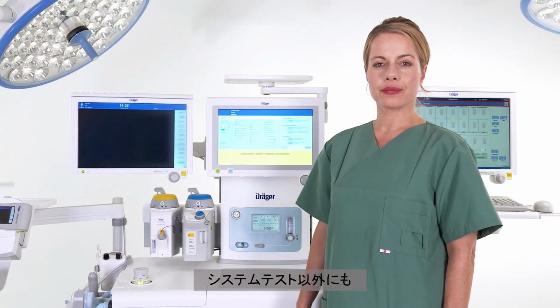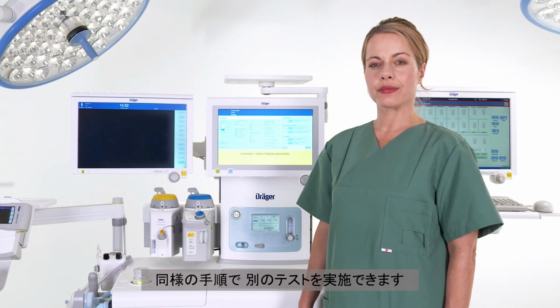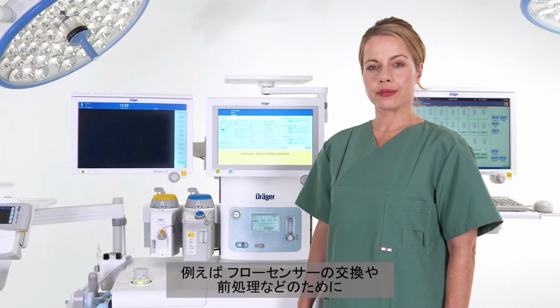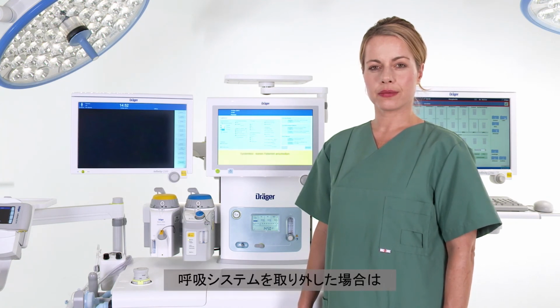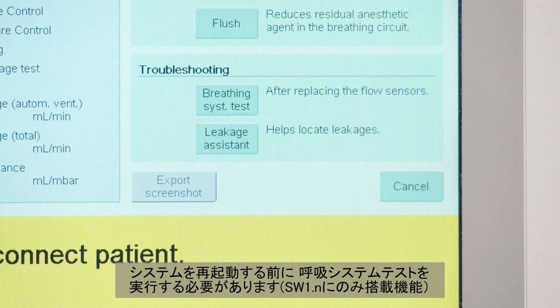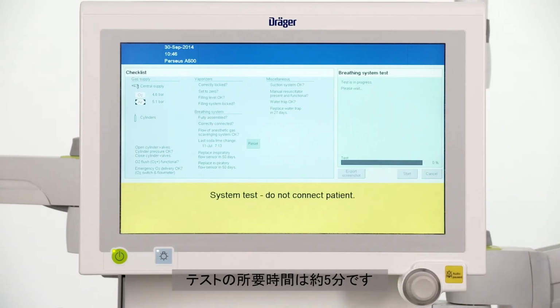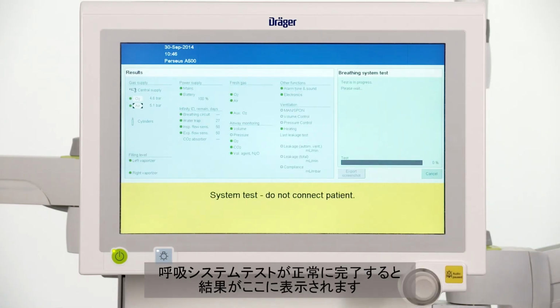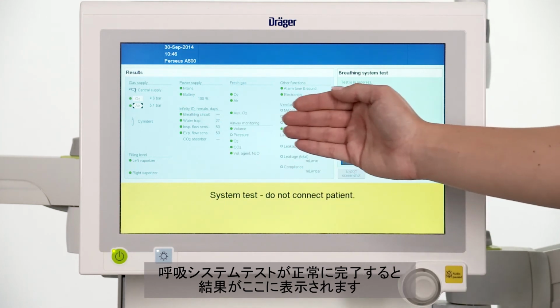Apart from the system test, you can use additional tests which all follow a similar procedure. If you have removed the breathing system to exchange flow sensors or for reprocessing, for example, you will have to perform a breathing system test before restarting the system. The test takes about 5 minutes. After successful completion of the breathing system test, the results are displayed here.